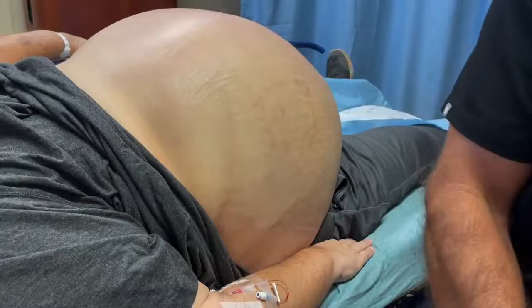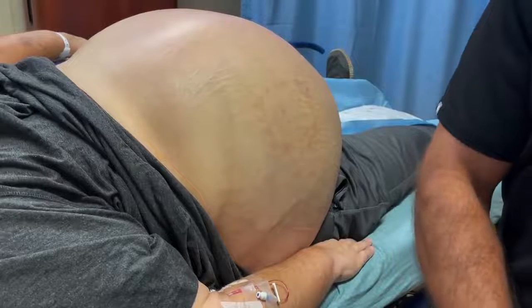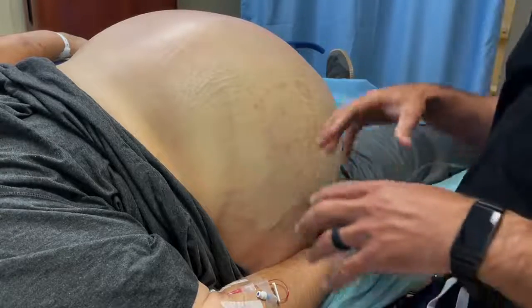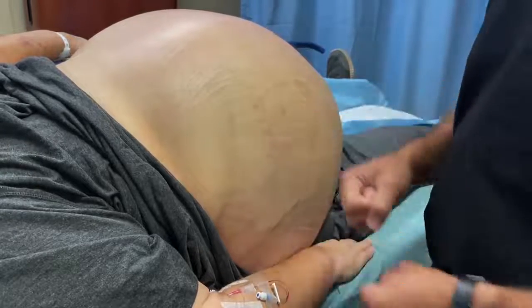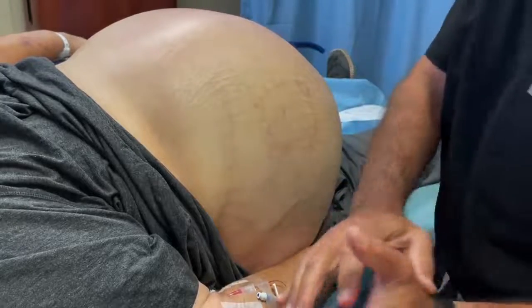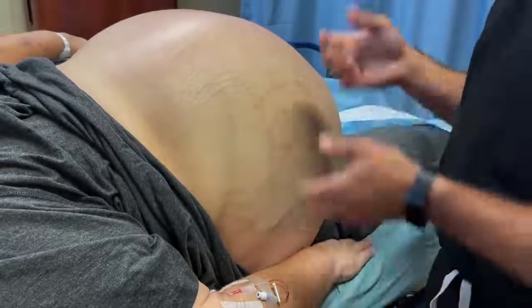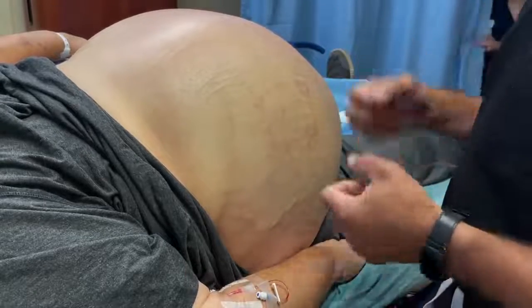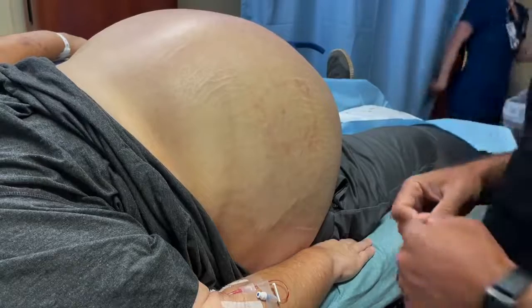Now he's already received through the IV a dose of albumin, a 50-gram bottle. The reason we do that is because we want to make the blood nice and thick, so that once we remove this fluid, the body's not going to try to remake all the fluid and he can become hypotensive, tachycardic, and become sick. So by making his blood thicker with more protein, it stays in the intravascular space.